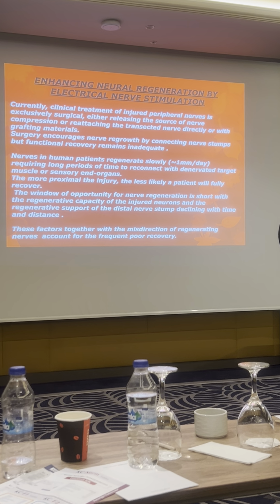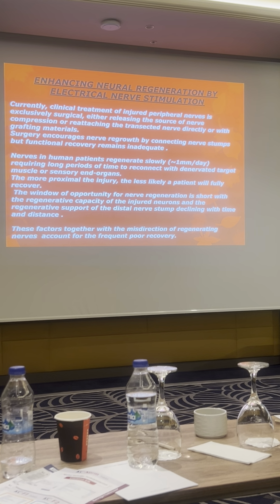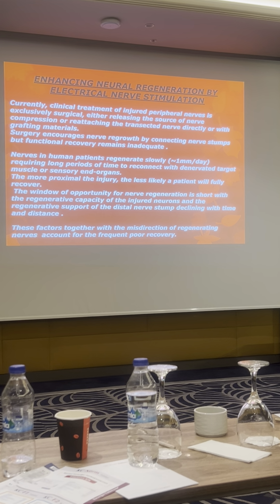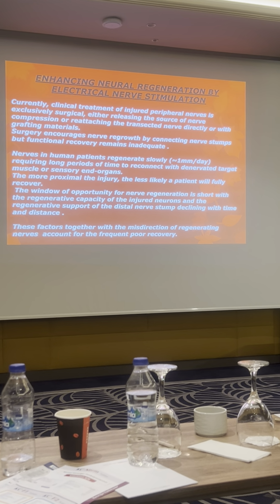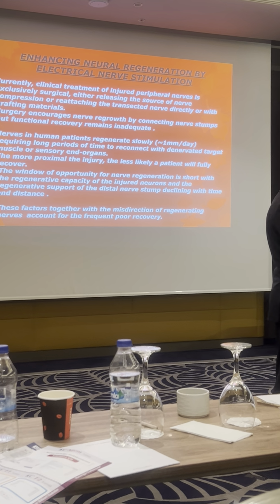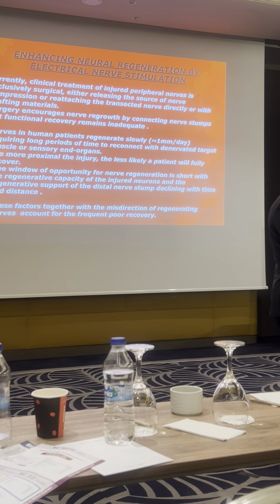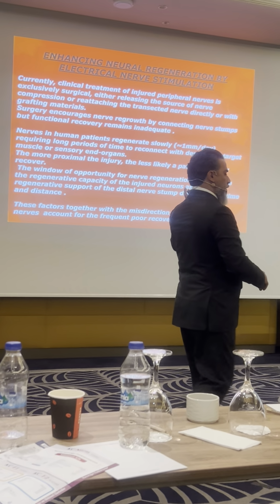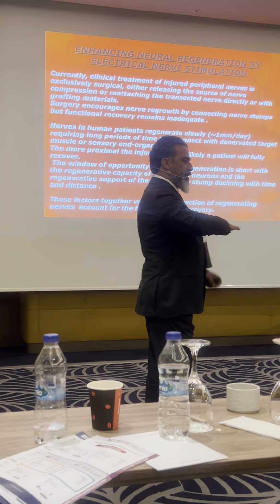Previously, physiotherapists used TENS, electrical stimulation through the skin to the muscle to the nerve, to enhance functional rehabilitation. But here, in the era of ultrasound and this technology, we can go directly to the damaged part, the fascicles of the nerve. This is like invasive physiotherapy, we can call it. So here, with direct electrical stimulation, there is no loss, no scar.